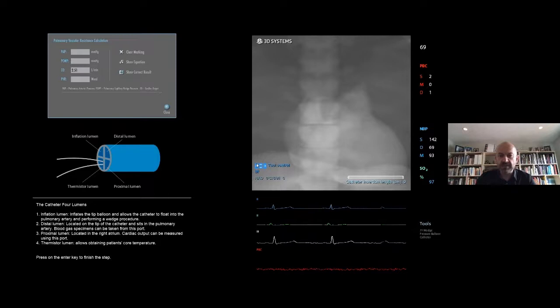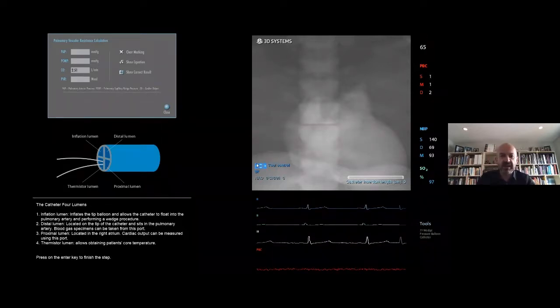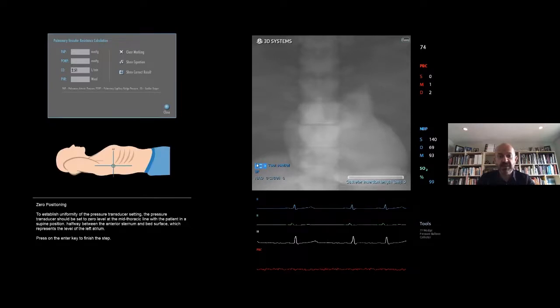So what I would recommend, and I think we discussed this before, is that it's good to see fluoroscopy, but imagine you just don't have it, because that'll help you understand where you really are, especially if you've not used fluoroscopy. Most cardiologists are familiar with fluoroscopy, but the vast majority of people don't use fluoroscopy for this. So I think it's a good way to use fluoroscopy. So here in this simulation, we're assuming we're coming from above, and it looks like you were coming from the right internal jugular. So why don't you go ahead and start inserting the catheter?